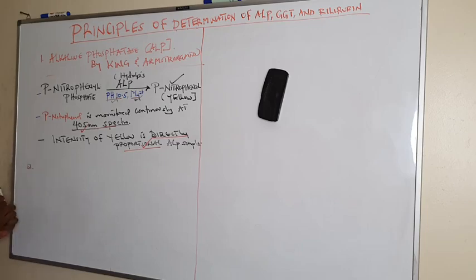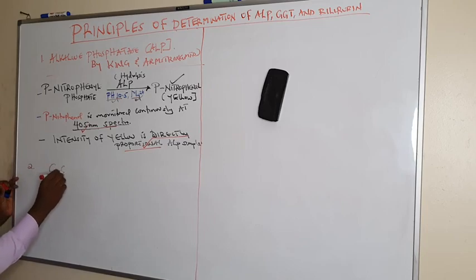The second we want to talk about is GGT, which is gamma glutamyl transferase.